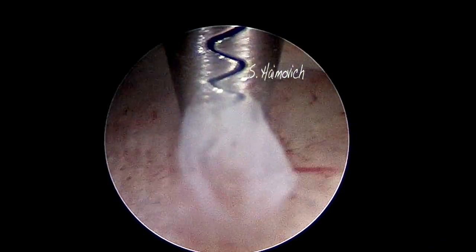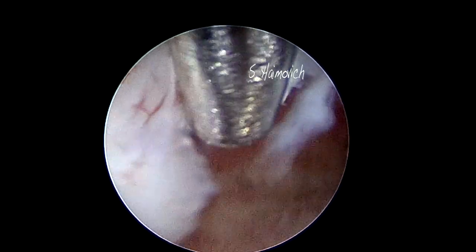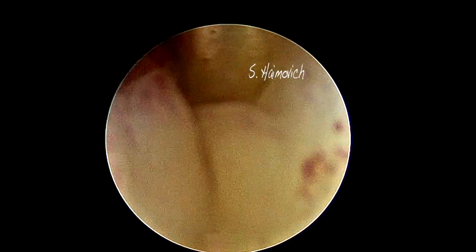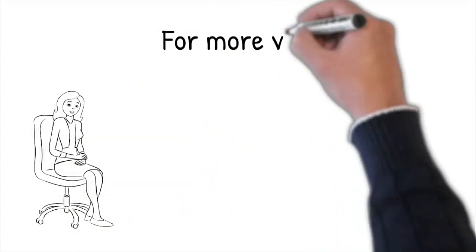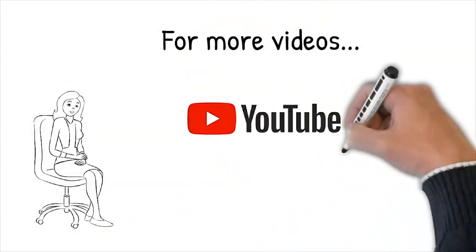In order to remove the free polyp from the uterine cavity, grasp it, and then bring the grasper with the polyp very close to the scope. Then slowly remove the scope backwards. Remember, never try to remove the polyp through the working channel.